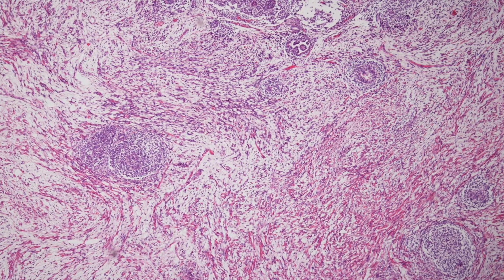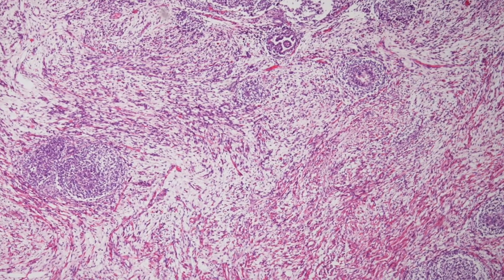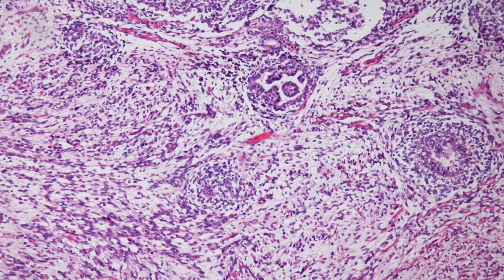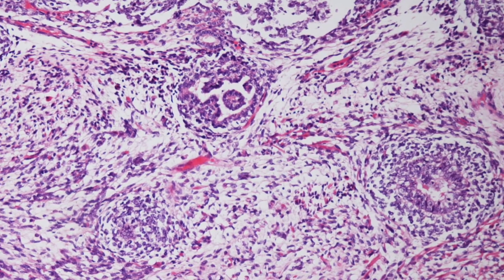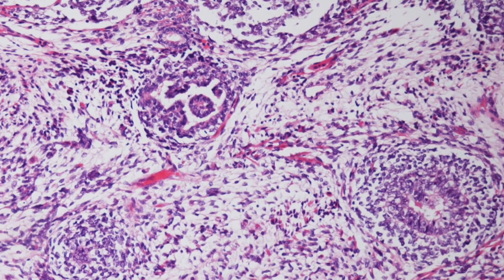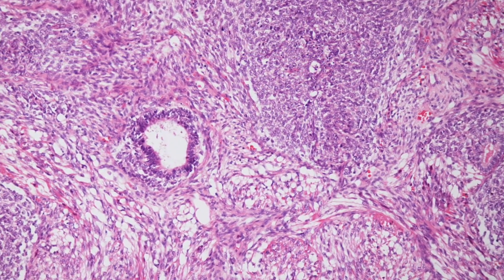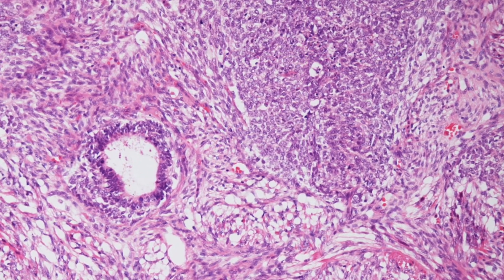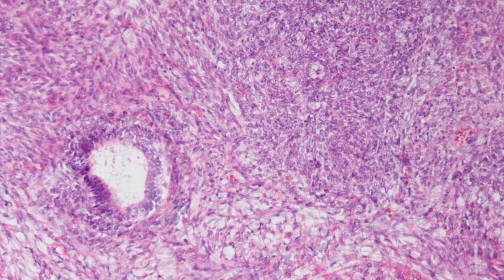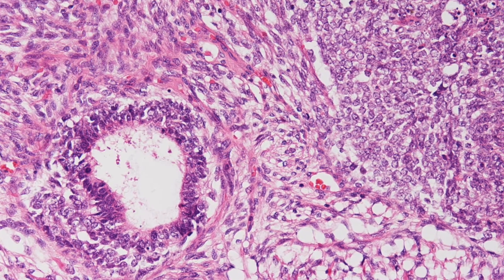Here are some representative fields from this tumour. Here are some examples.